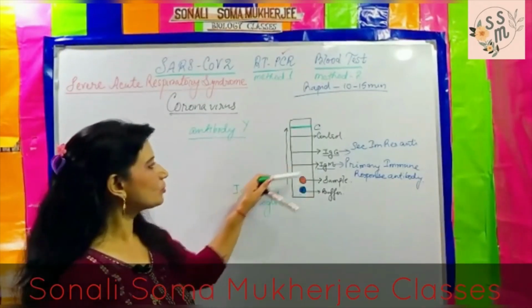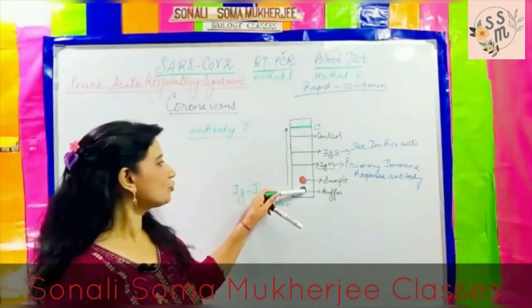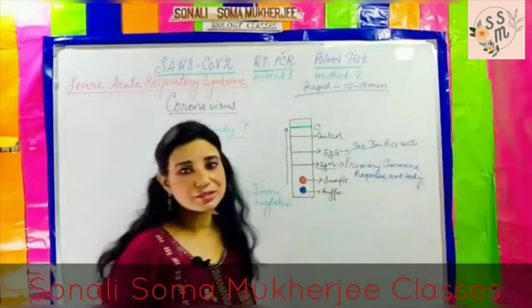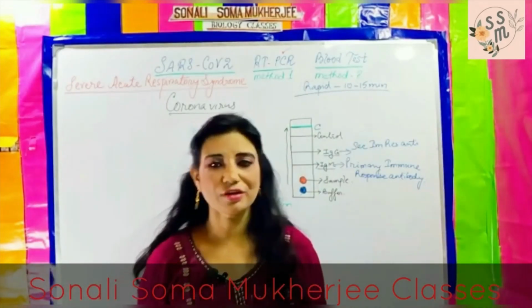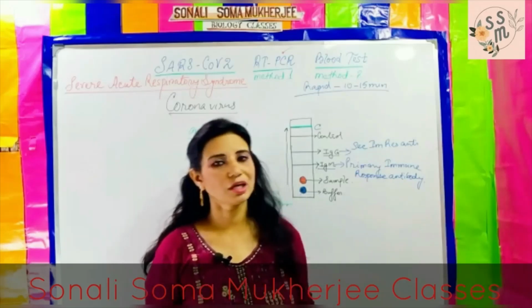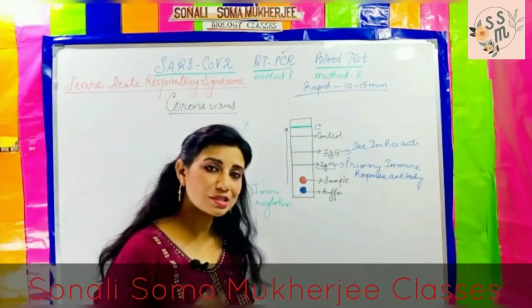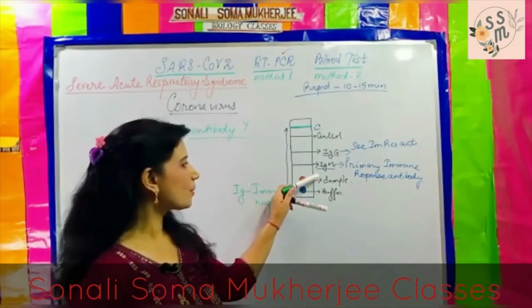Next, as I am finished with the C line and IgM, now I am talking about the secondary immune response. Suppose you run the test and you find there is a line in IgG, that is the secondary immune response antibody. That does mean that you have been infected with this virus earlier, much earlier. This infection was there and now you have developed some immunity and you are in a safer state, but you are still positive. So this is a concern, IgM and IgG.